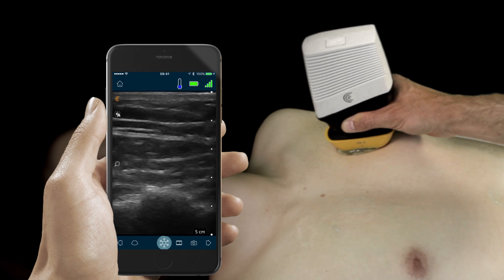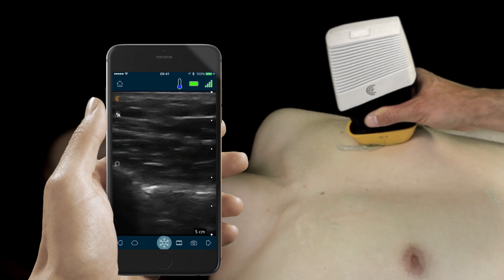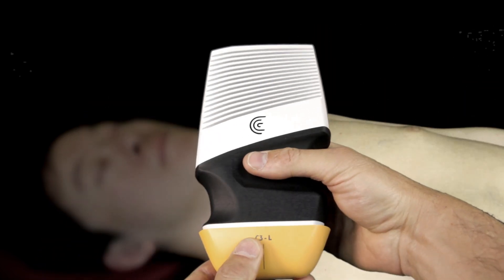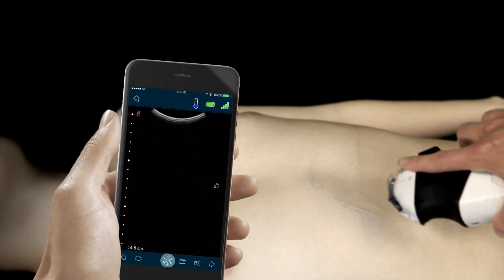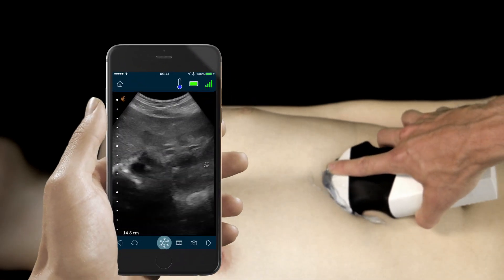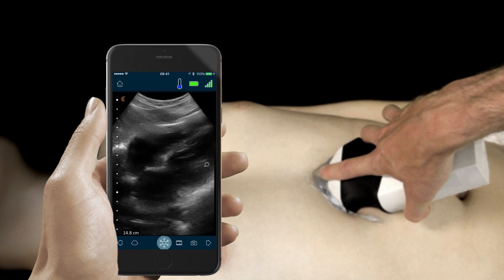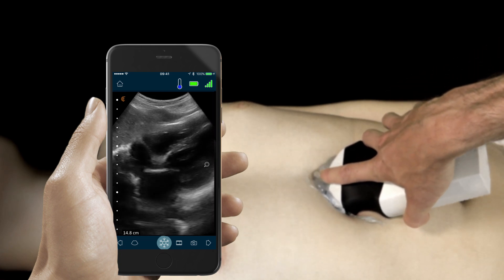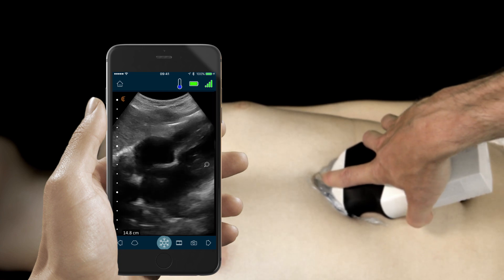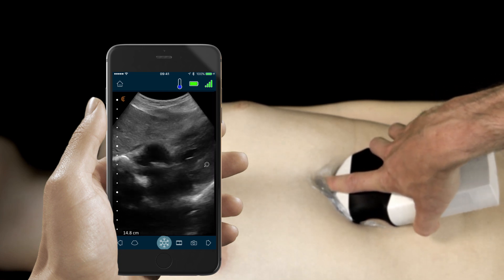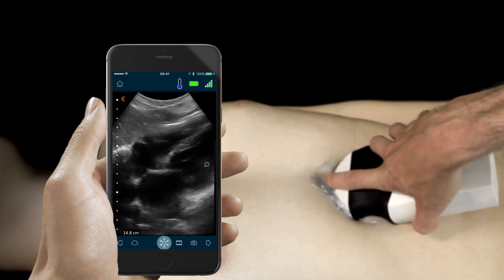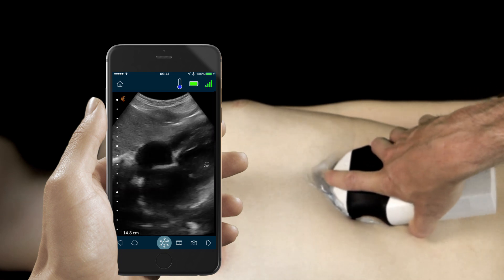We can go ahead and move to the contralateral hemithorax and repeat the process. Next, we'll be looking at the heart using the sub-xiphoid window, looking for any sign of fluid in the pericardial space. If you're not able to generate adequate views from the sub-xiphoid area, you can use the Claris clip-on attachment to generate views from the precordial windows.